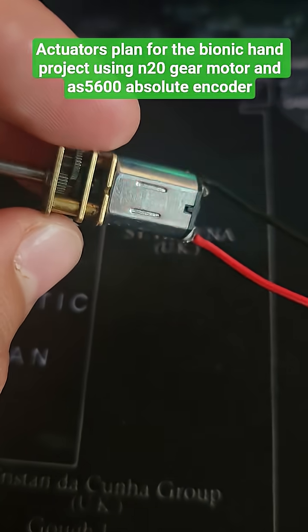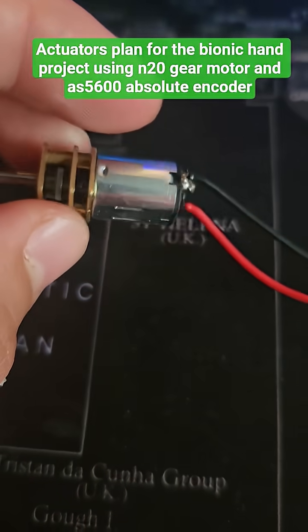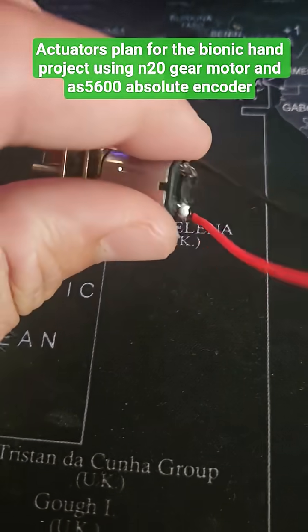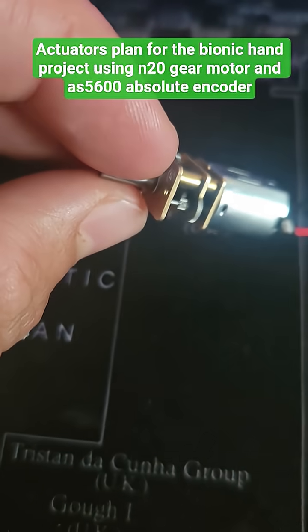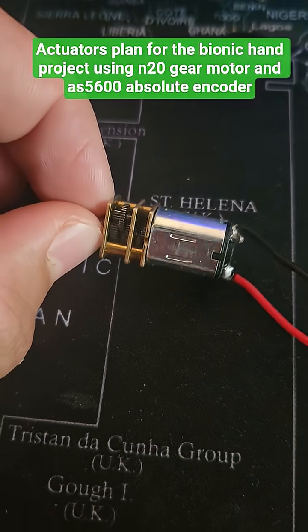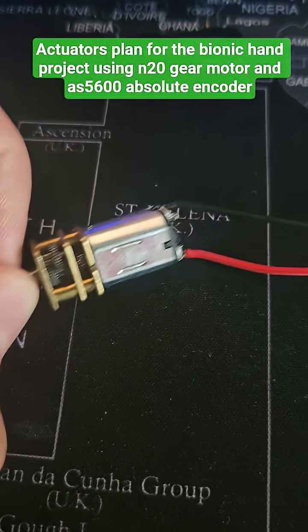I just got these N20 gear motors. Had to resolder some new leads on there. It was about a buck fifty for each motor — I got six.